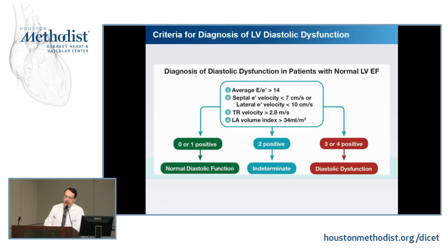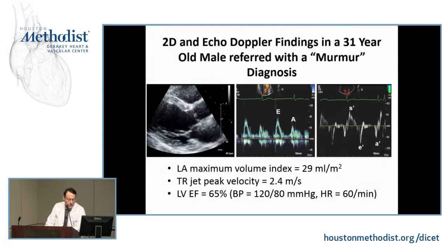So recognize that the indeterminate yield is also affected by the quality of the exam and how compulsive these elements have been acquired. Aside from the annular velocities, you can say that all good echocardiographic studies should have a TR jet because we want to report PA pressures, and should have a good look at the LA volume, which is a predictor of outcome in many patient populations.